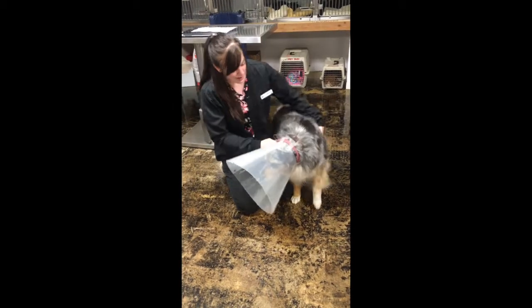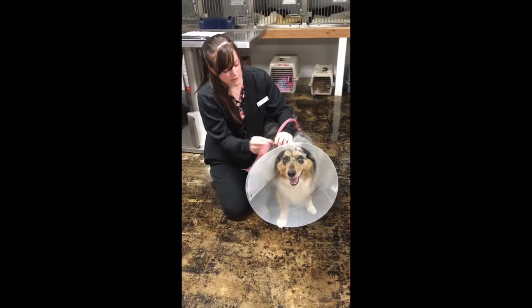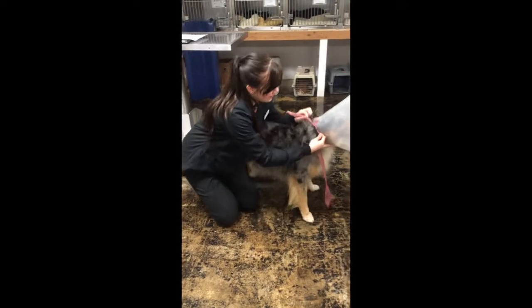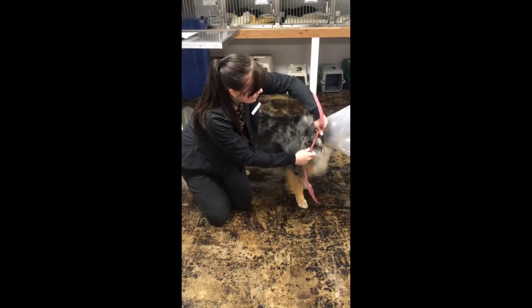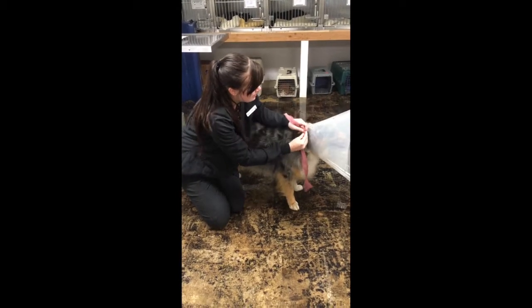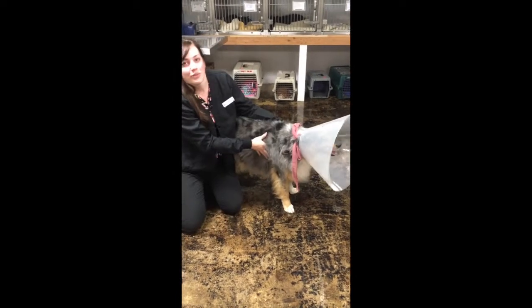So now that I've got it around her head, I'm going to go ahead and use the gauze we have around the e-collar to tie it down. You want to make sure you can fit 2 fingers in between the patient's neck and the string, so you don't want to suffocate them. I'm going to go ahead and tie it in a bow, and that's how you apply an e-collar to a patient.